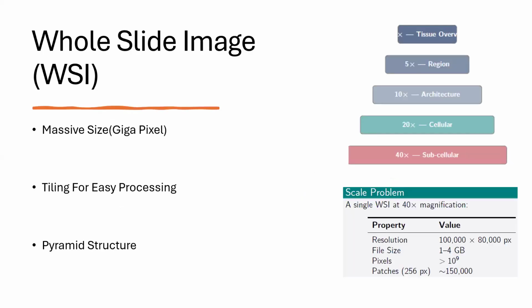And this is the whole slide image which we are going to give to our model. When we take any dataset for medical image processing, this is the way in which you get the histopathology data. As computer engineers, we should focus on this part only, but the previous part is very important as it reveals the real facts about the data.